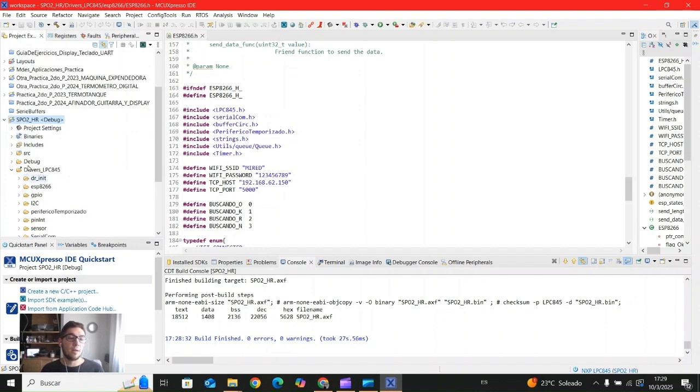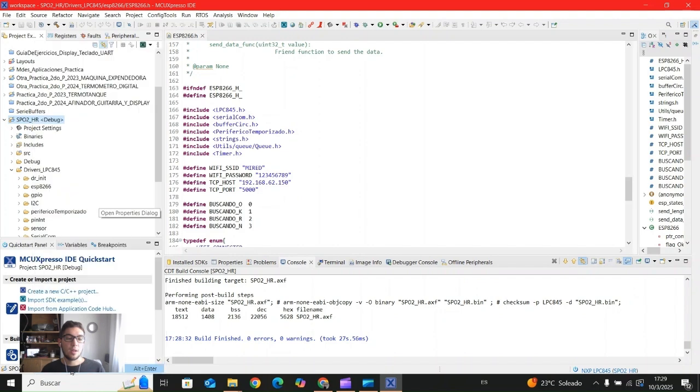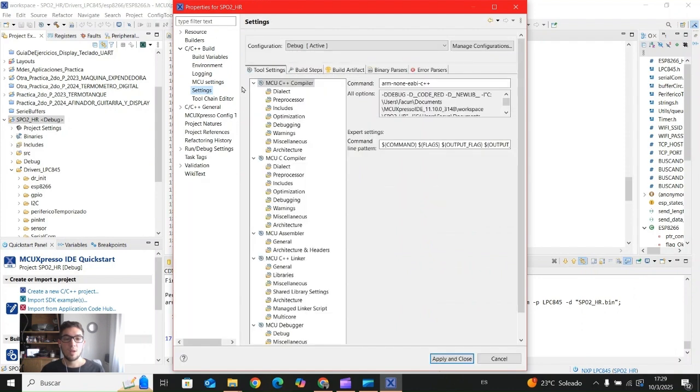Okay. One configuration typically that we would like to maintain is the include path configuration. When we include any library or something, typically we need to indicate from where we want to read or where we want to look for a file. So typically we would go to C and C++ Build, to Settings, MCUXpresso compiler or MCU C compiler. In this case, it is a C++ project.